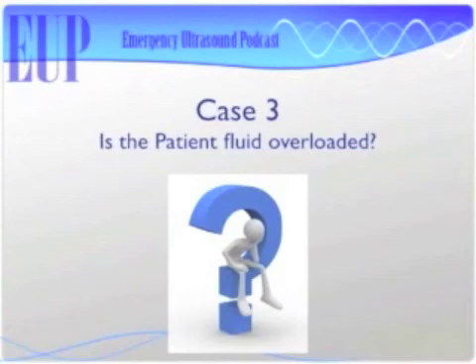This is not the standard of care right now for emergency physicians, to be looking at diastolic heart function on patients that come in short of breath. But you're an emergency physician. You know this stuff. You can do this stuff. There was also that study that we went over, right, with 140 patients, where ED docs went through a 4-hour didactic session to learn how to do this, and with better sensitivity than BNP or Boston heart failure criteria, diagnosed people with heart failure.